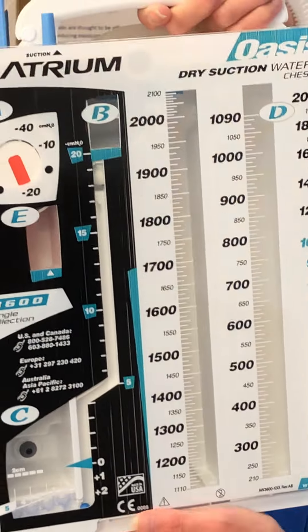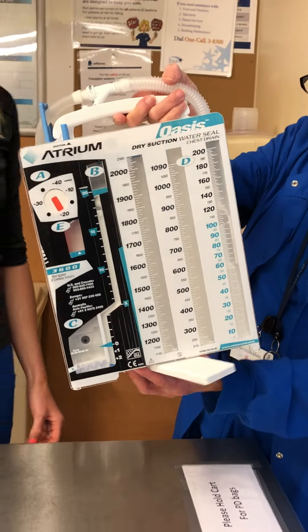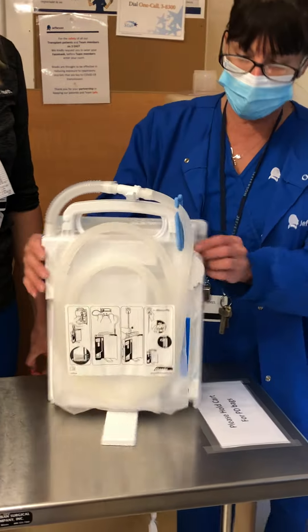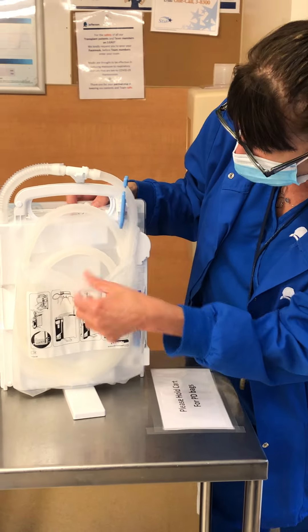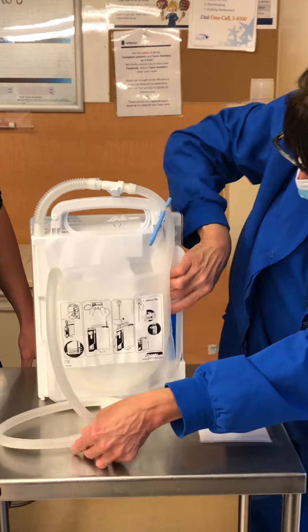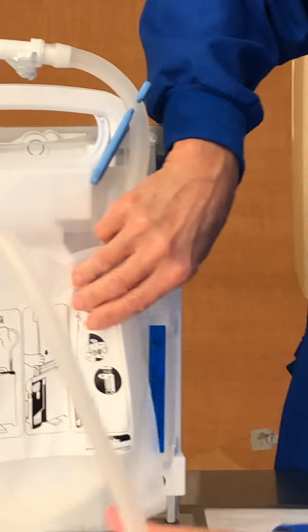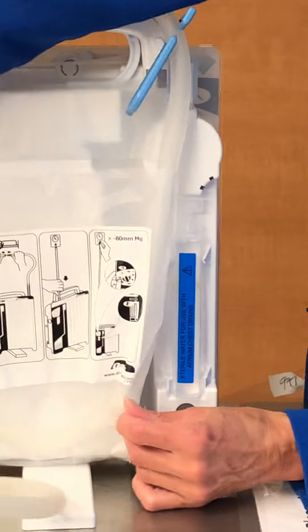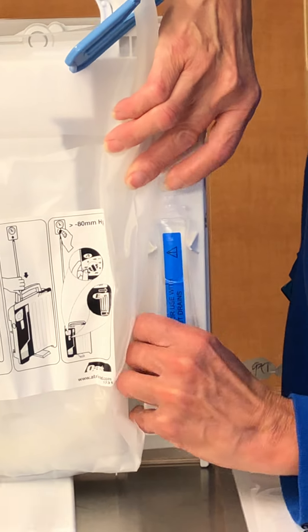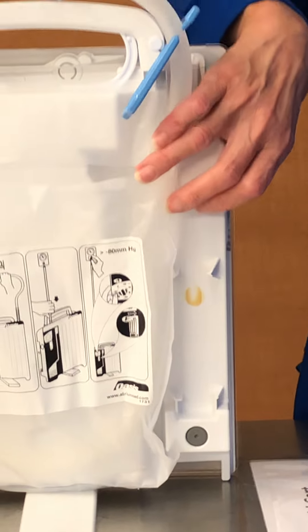Here is your chest tube. It has a little kickstand like this. If you turn the chest tube around, there is right here a little vial of sterile water. You just pop that off.